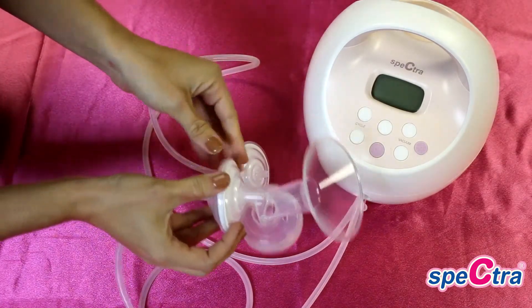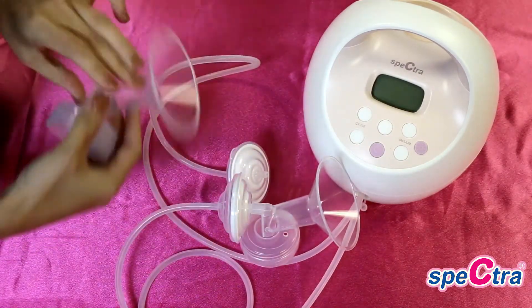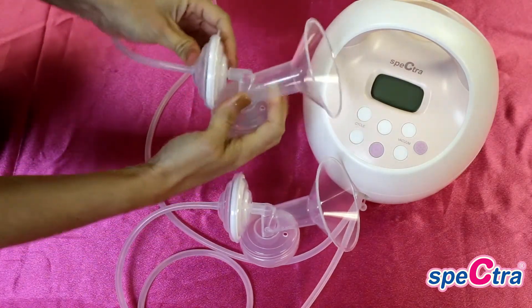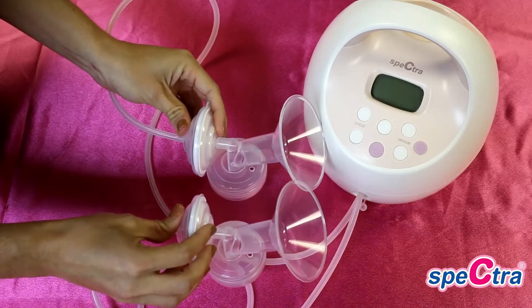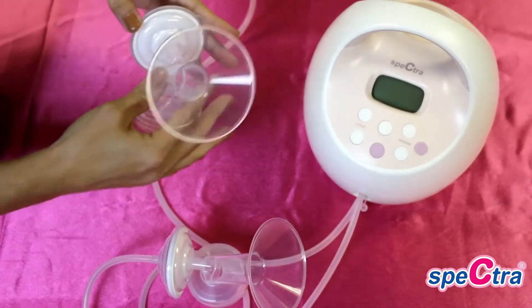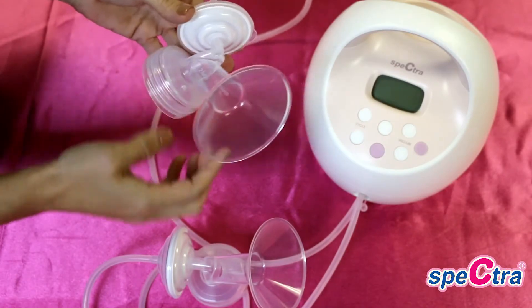Your pumps come with 24mm shields. We also carry a 28mm and 32mm shield if you need a larger size. If you need help on determining what size flange you are in, please see our sizing guide.